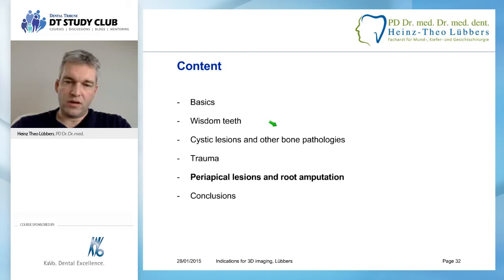And once you see one, you definitely want 3D imaging to judge whether you need surgery or to pre-plan your surgery. So after all, in a fracture of the orbit or a suspicious situation for a fracture of the orbit, you would want a 3D image. That can be a medical CT, of course, because in head trauma, you sometimes suspect bleeding and other problems. But if you don't suspect other problems, you can also use a cone beam CT and spare the radiation dose, let's say.